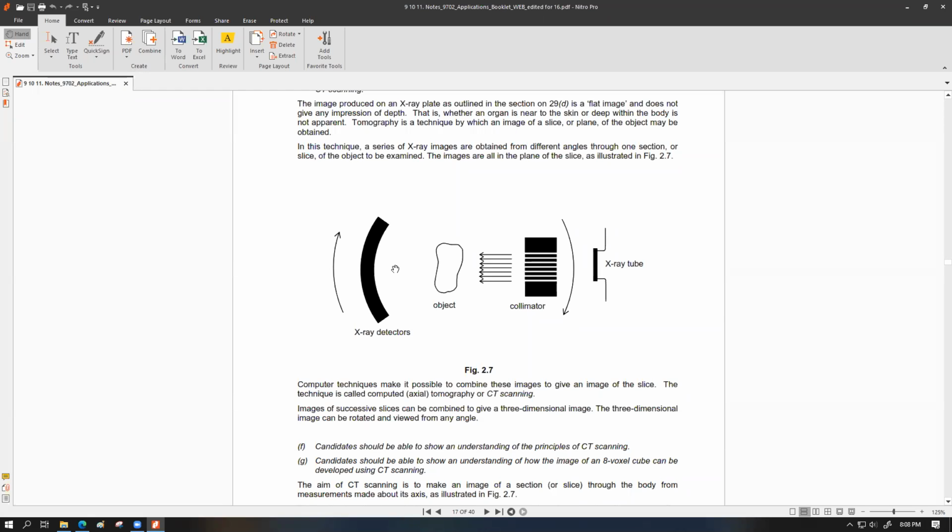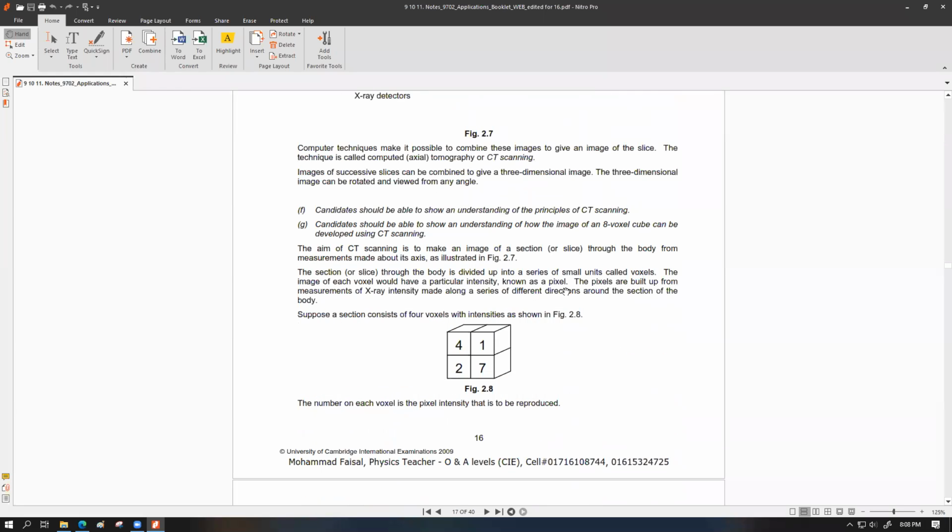But the moment we start to make the voxel size smaller, the calculation or the math or the data that we're going to produce is going to become big, which is obvious because we have a more detailed image, which means we have to handle a much bigger amount of data and be able to process that with appropriate efficiency. So that's the idea of voxel.